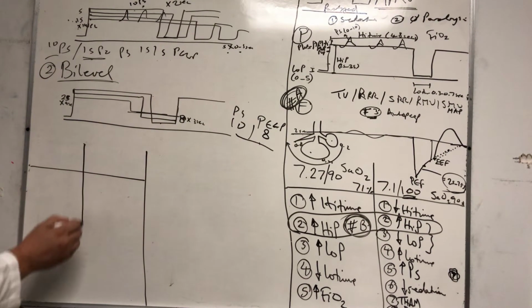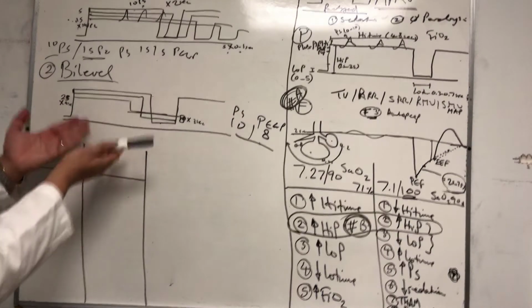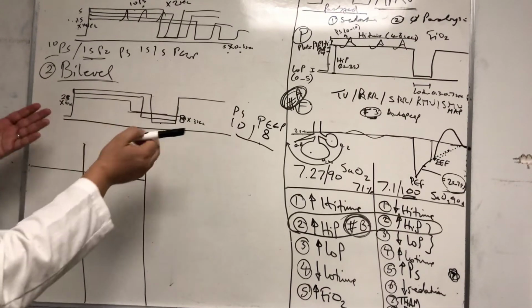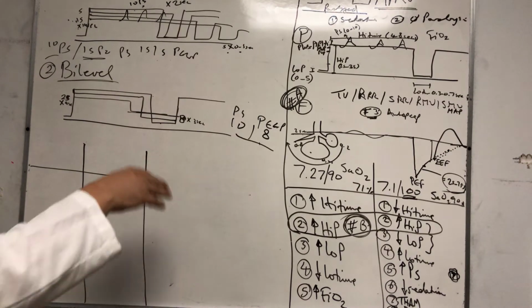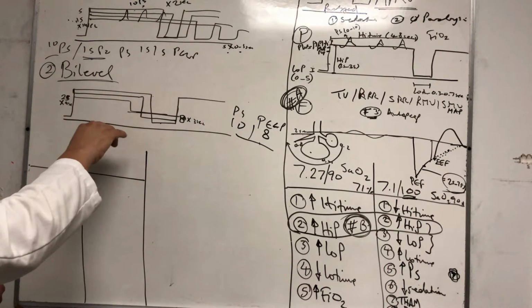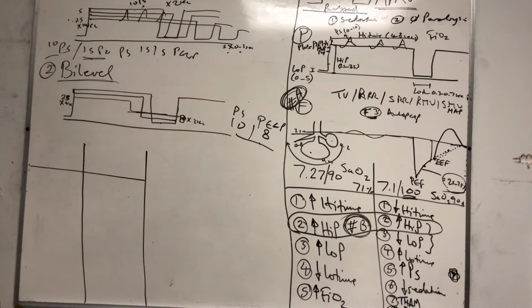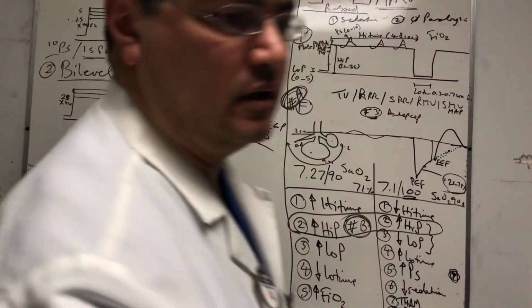Are we going up on the low pressure to prevent full collapse? Yeah. But in theory, if you're weaning someone, at some point you're not going to keep going up on their low pressure, right? Yeah, you're right. Well, that's what the bi-level weaning is. He's still going up on this every time, and then at some point you'll say, okay, we met at 15, for example, and we're just going to put you on a breathing trial at that time. You're right.